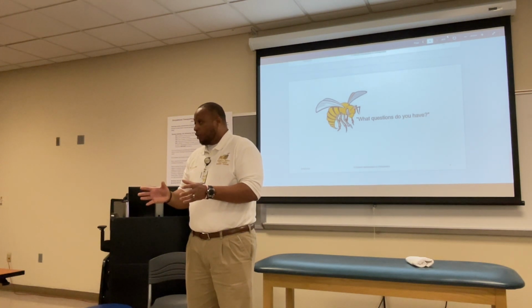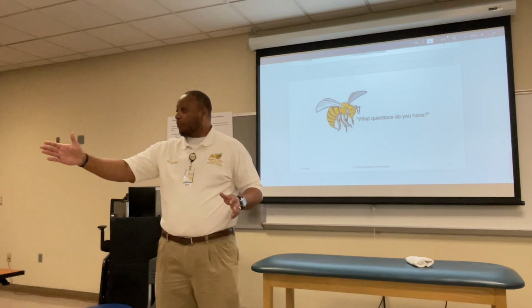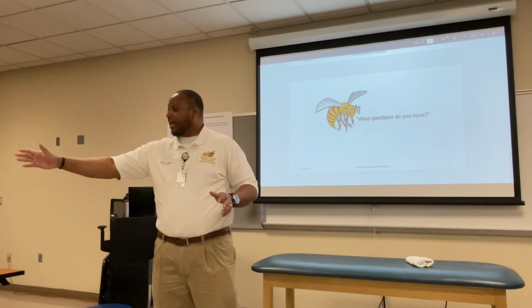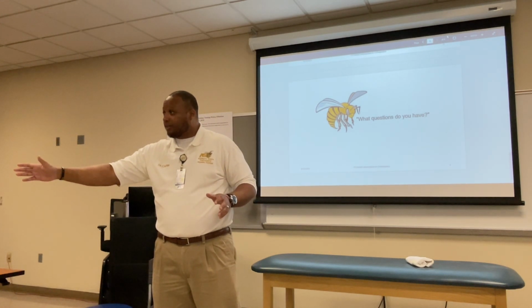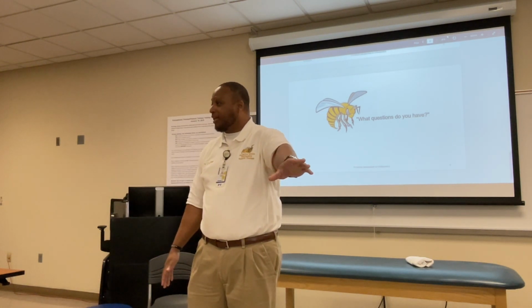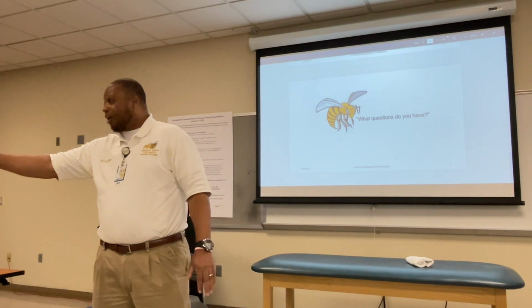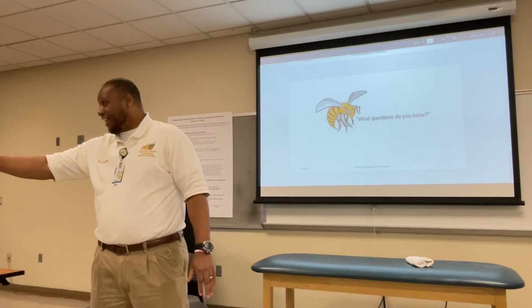Okay. So now, if you take knee flexion and your knee flexion active range of motion is 120 degrees, Taylor comes back and takes it on the same person and it is 110 degrees. Acacia comes and takes it, she only gets 90 degrees. Liz takes it, she says, I get only 80 degrees, 0 to 80 degrees of range of motion, right?